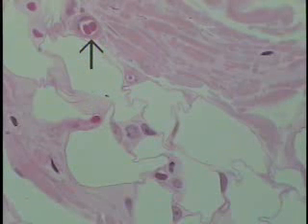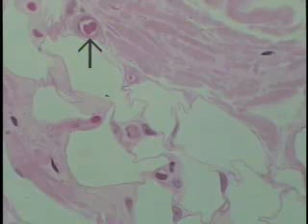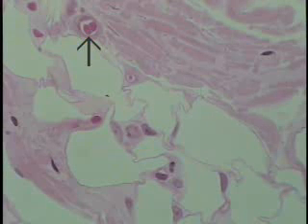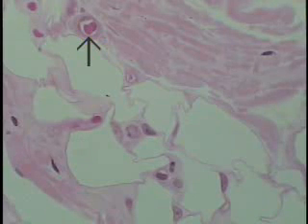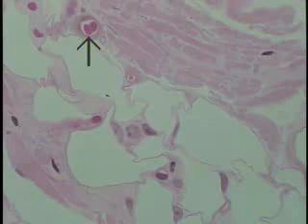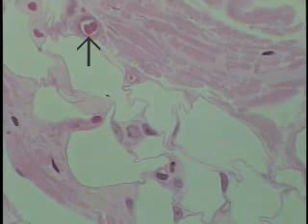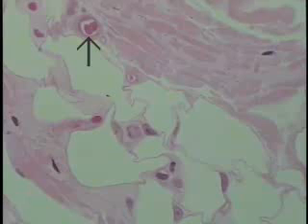A more typical capillary is shown here: the endothelial cell nucleus, and then the endothelial cell cytoplasm plus its surrounding basement membrane, making up the overall width of the vessel wall. It should be remembered the number of these capillaries. This part of the vasculature is substantial. This is where exchange takes place, and the total surface area for this exchange has been calculated to be somewhat over 100 square meters in the human body. So these very small capillaries form a substantial population of blood vessels, so this exchange can be effected.